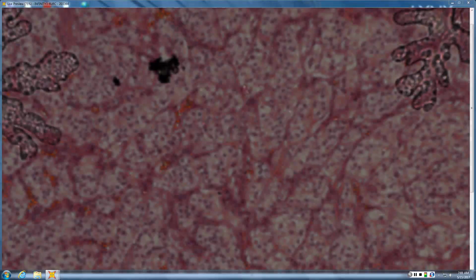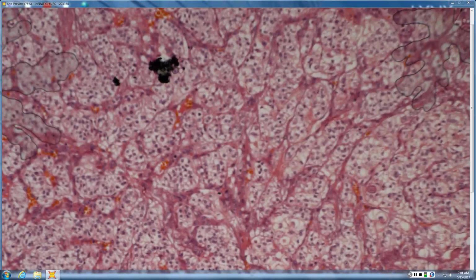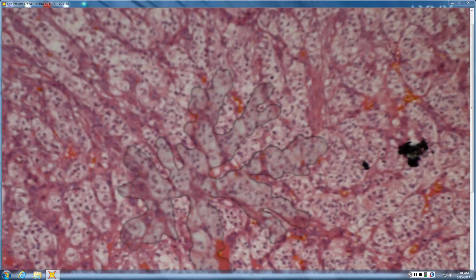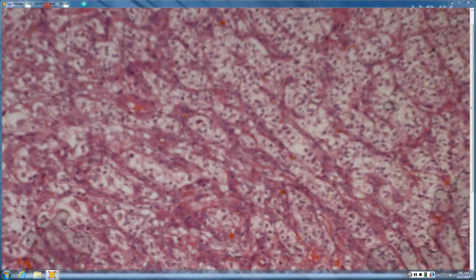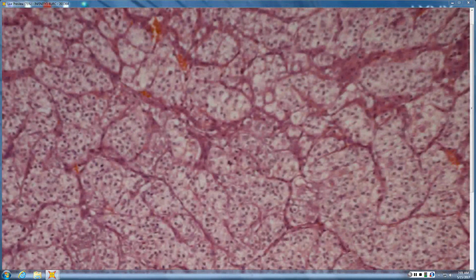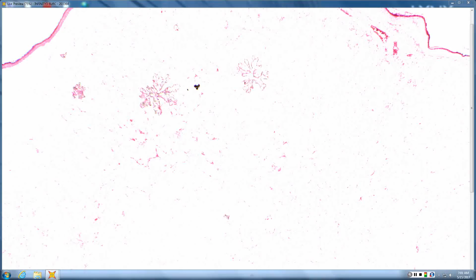So as you get closer in, it really doesn't necessarily have marked pleomorphism or weird mitoses or stuff like that. But with the right history and just remembering that on the differential, it's usually not that hard because it's so obviously clear cell in origin. So that's that one.